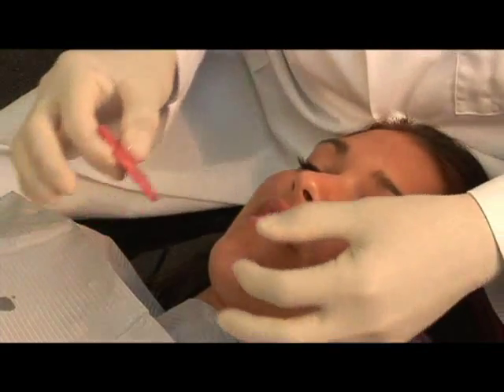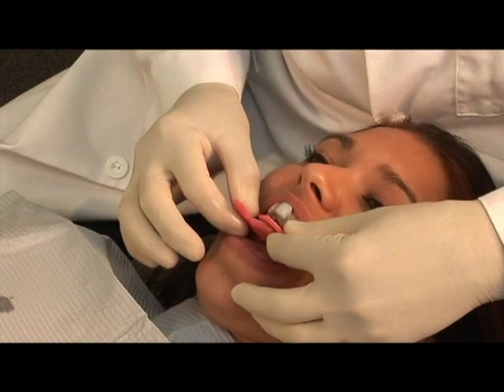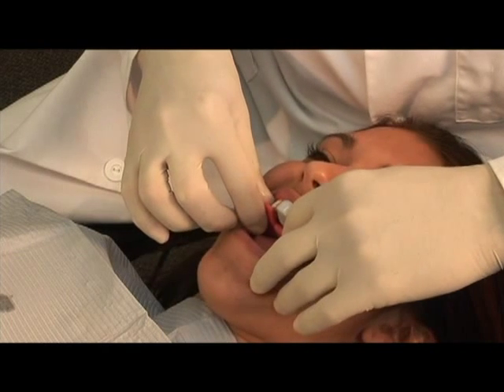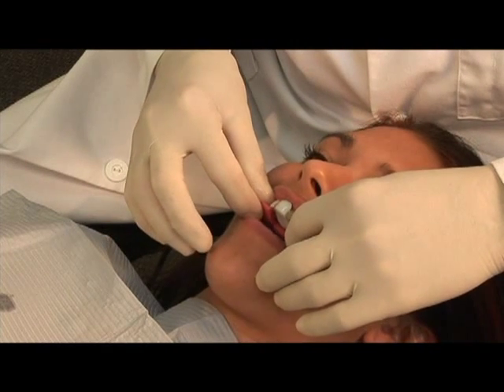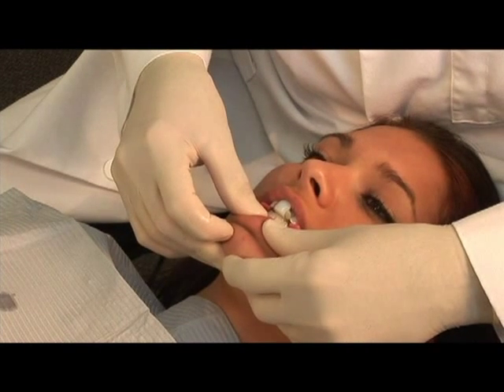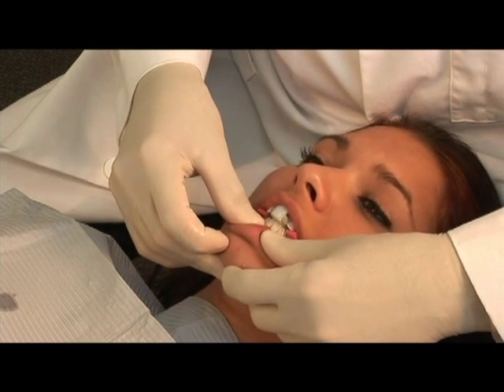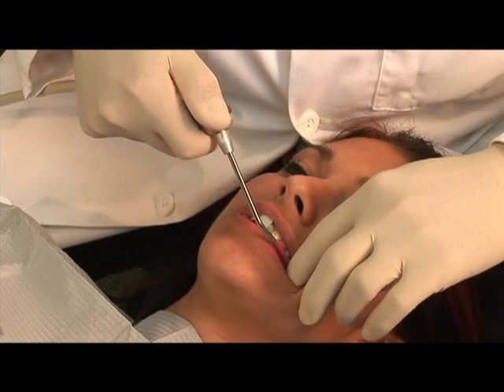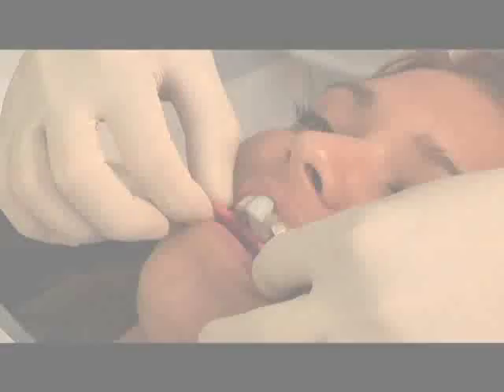With the Lucia jig in place, seat the wax record into the mouth. Have the patient bring their teeth together until cusp tips contact the wax record. Have the patient slowly slide their teeth forward and back. Once the registration is made, chill the wax record before removing.